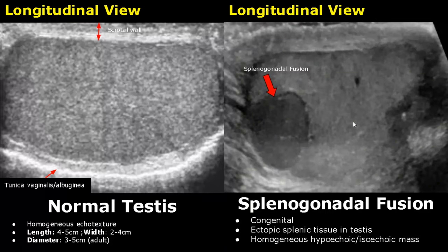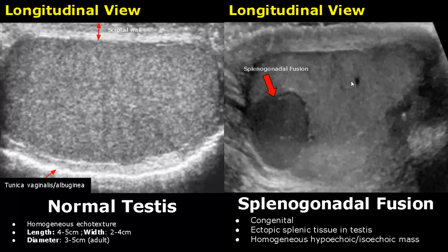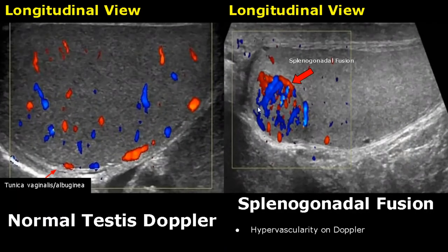Splenogonadal fusion is a rare congenital condition in which splenic tissue is found in the testis. You can see that it somewhat resembles splenic tissue — it is homogeneous and either hypoechoic or isoechoic to the testis. On color Doppler the splenic tissue will show hypervascularity. It is difficult to distinguish it from a testicular malignancy.